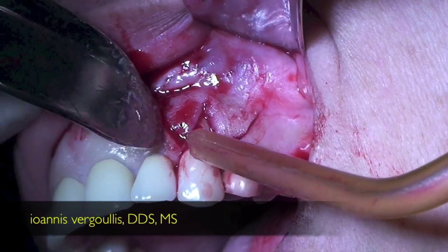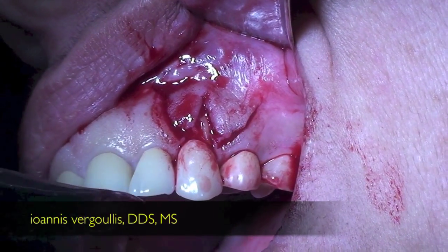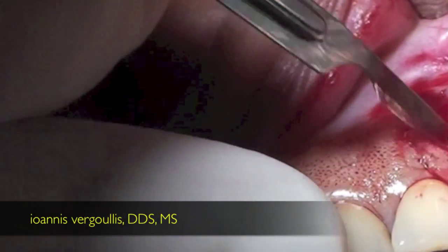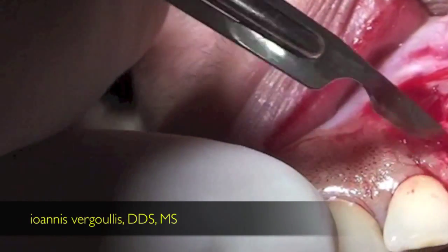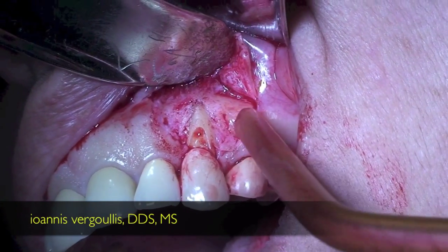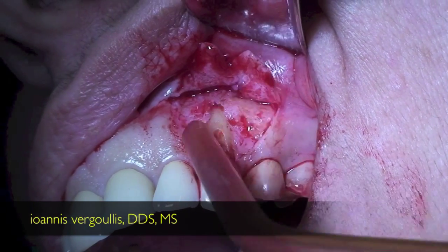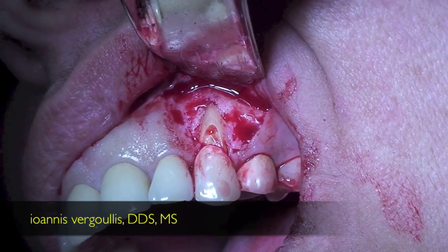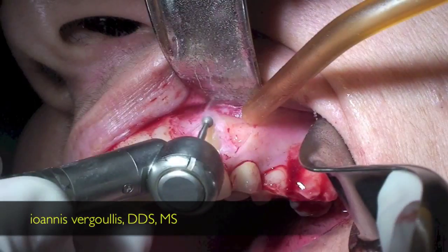We do a full thickness flap, trapezoidal with curvilinear incisions, followed by a split thickness flap. At the same time, we de-epithelialize the borders of our flap. And now we can see the amount of abrasion that is present and is associated with the recession.